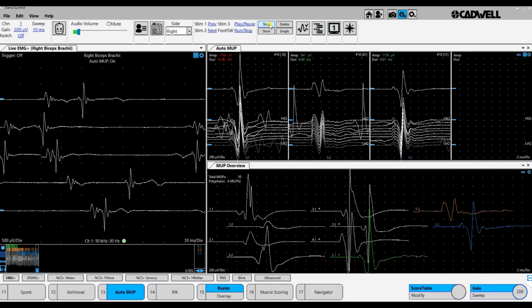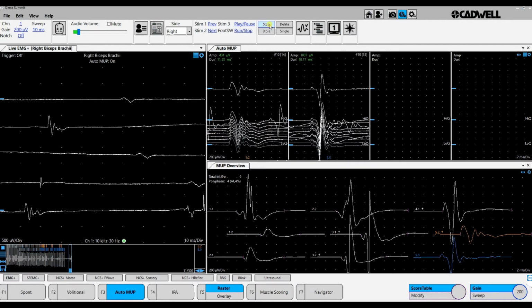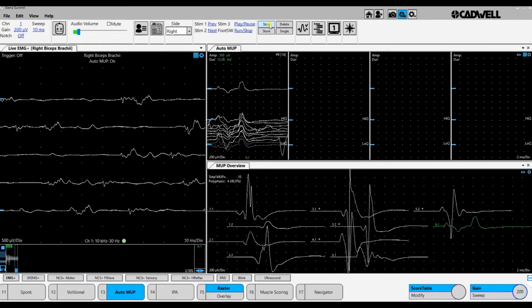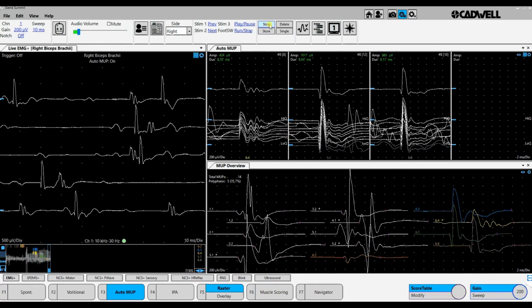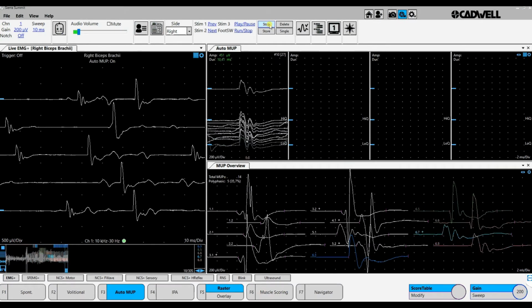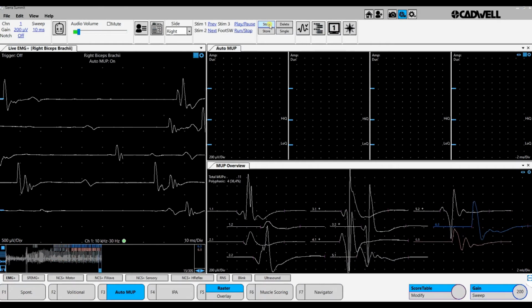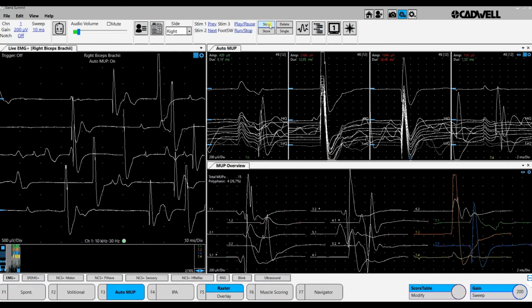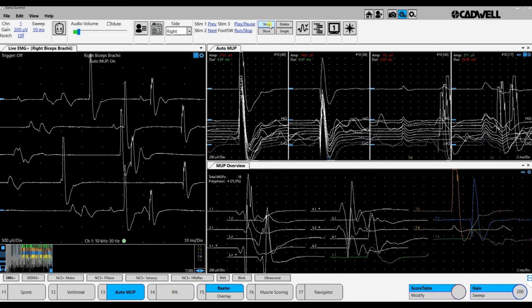Slightly different position. So then I move the needle again. Complex signal, and we accept this, and then we restart the analysis. New position, slight voluntary contraction, accept this.